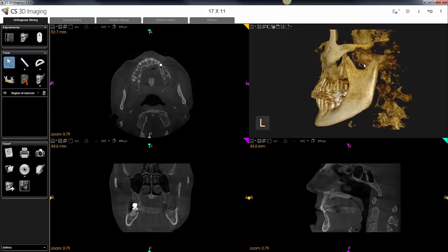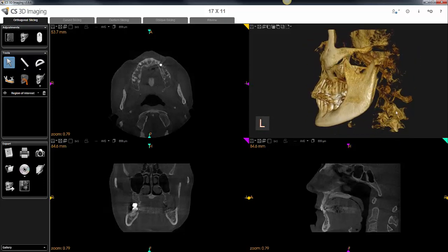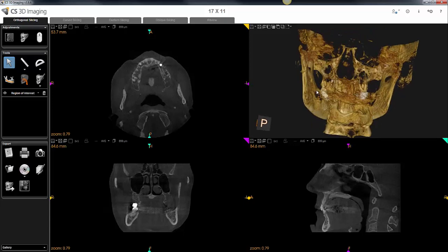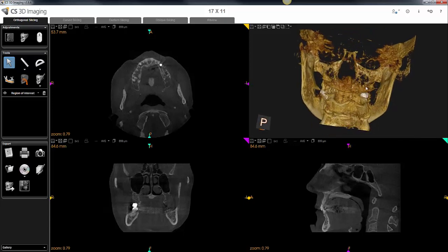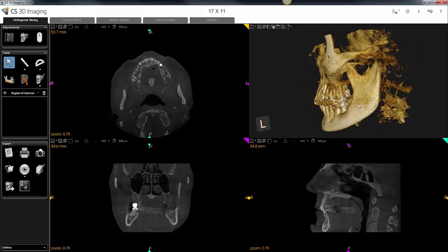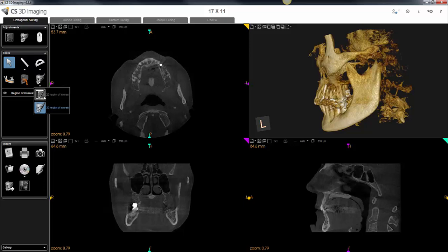The first tool you can use — basically what he wants to do is remove this portion of the 3D rendering so that he can visualize looking in this direction unimpaired. You'll find it on the orthogonal slicing tab. It's called the region of interest tool and you have an option of creating a 2D or 3D region of interest.